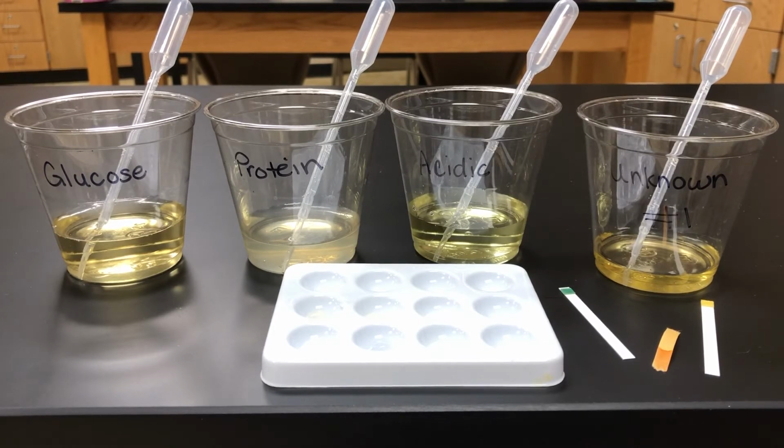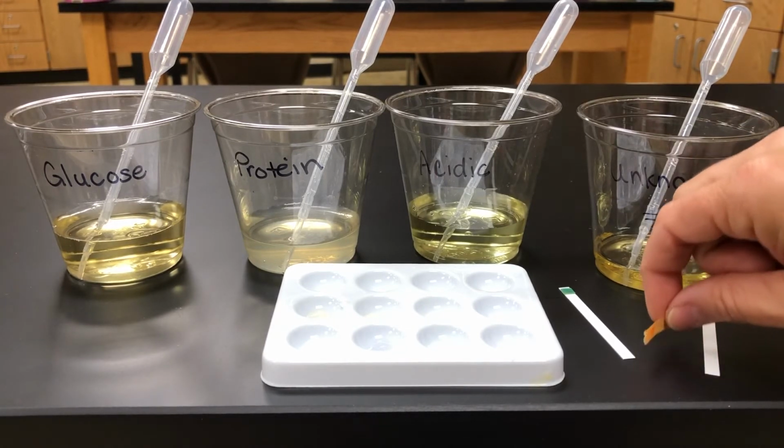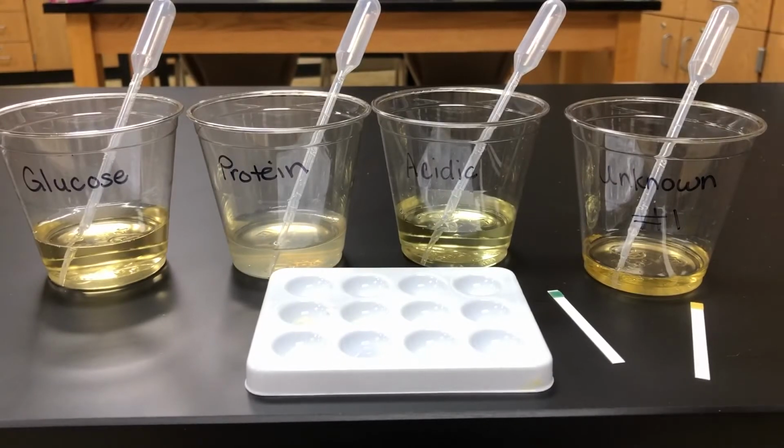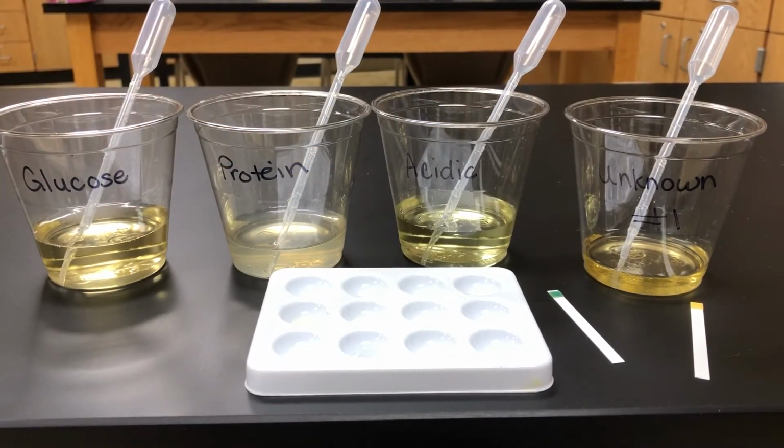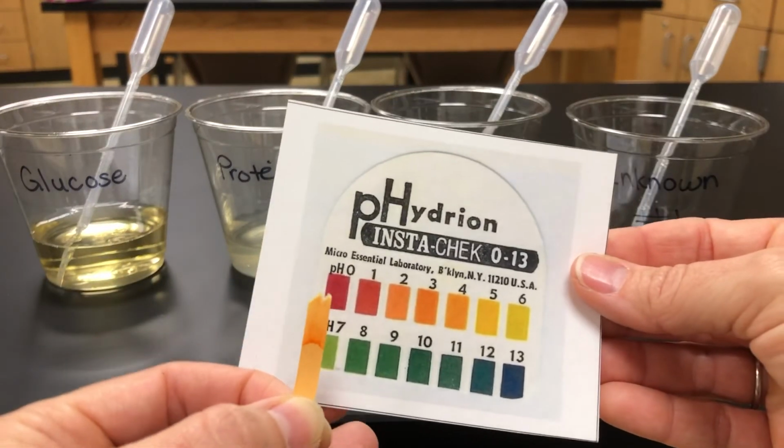Okay, so let's go ahead and go back to part A. We're going to look at the pH strip. Okay, so here is our strip. Let me get what we are comparing it to. Here's our chart.